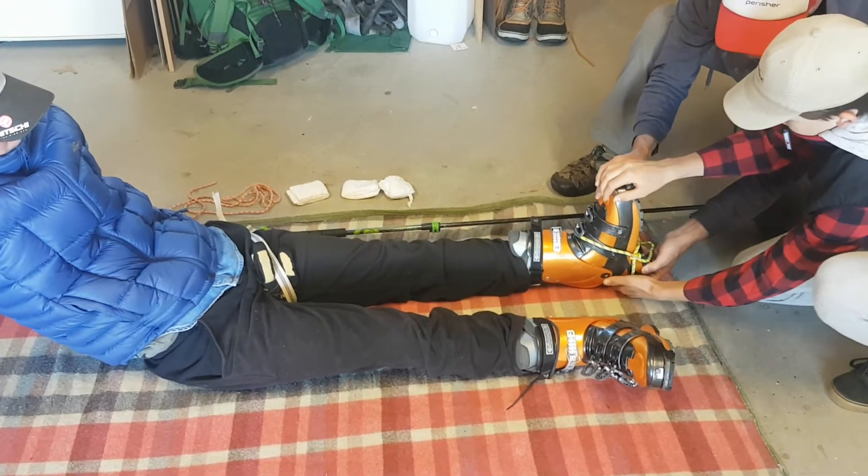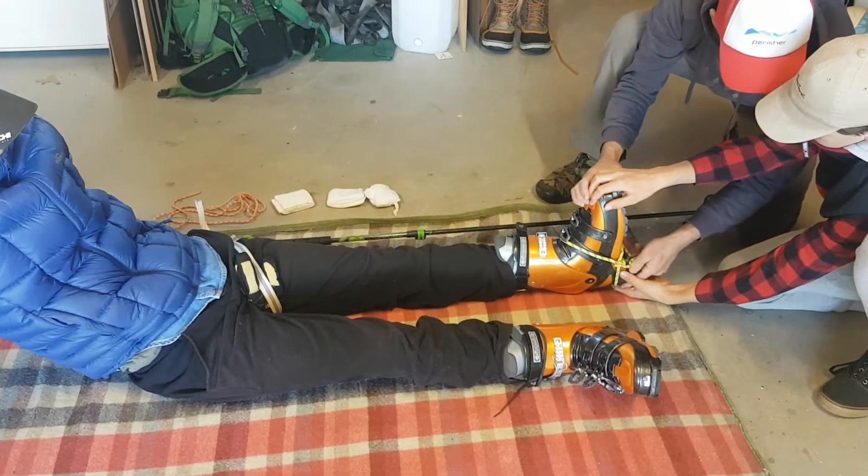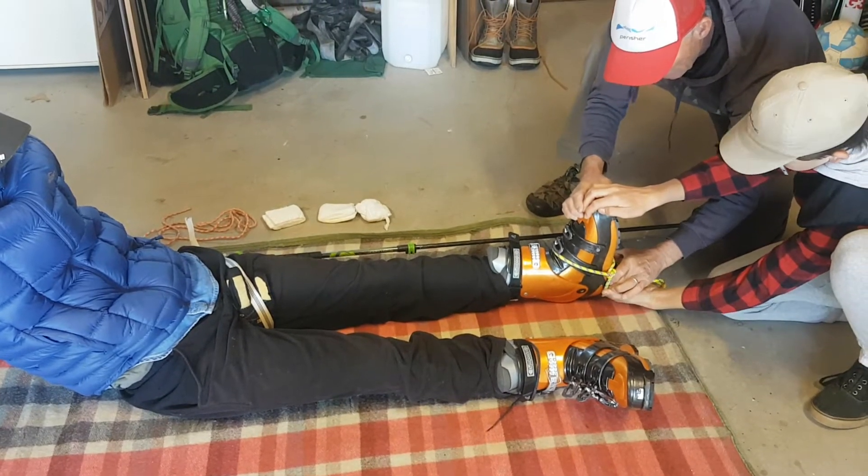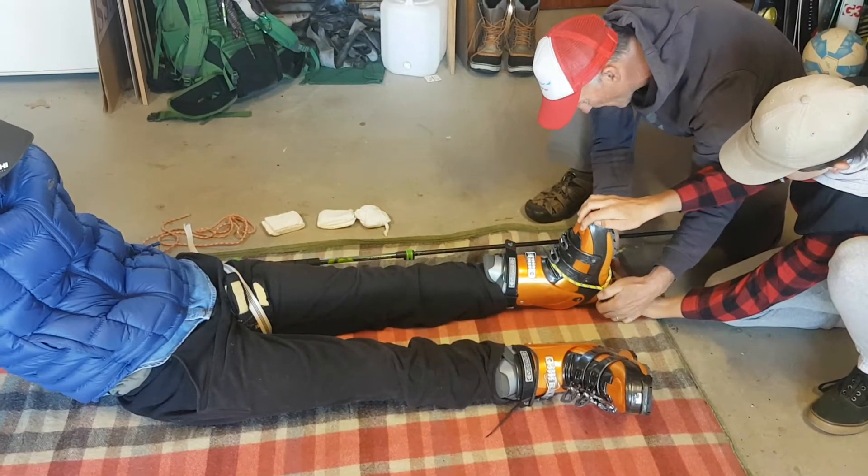Hold him there at the toe, because you've got to overcome that big strong quad muscle. You've got to hold that. You've got to overcome that muscle.